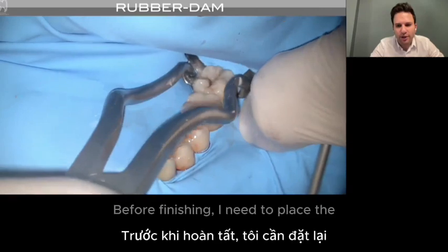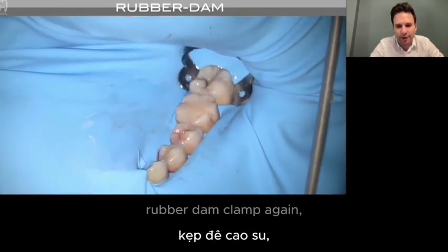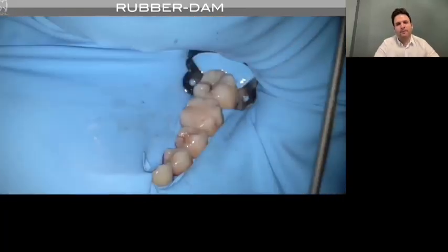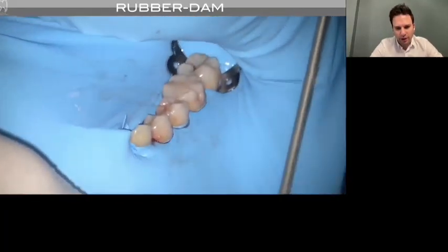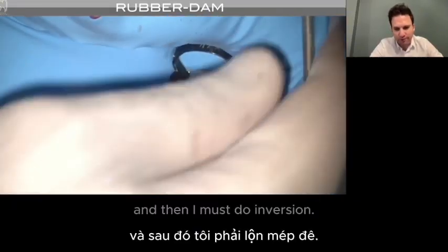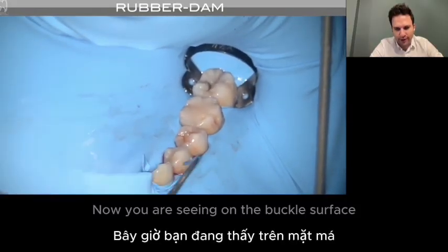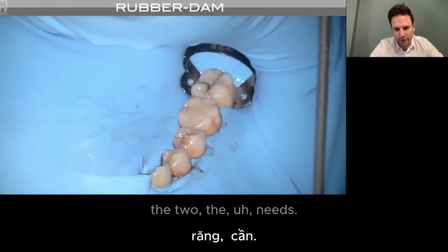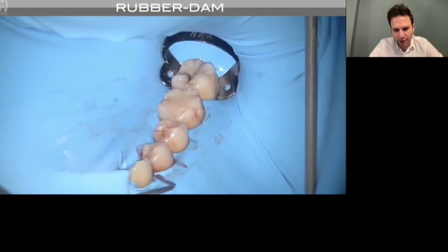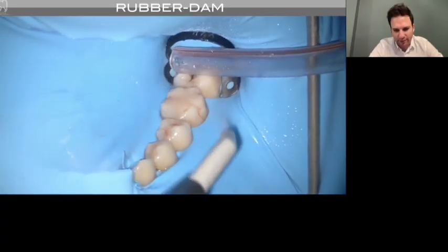Before finishing, I need to place the rubber dam clamp again, and then I must do inversion. Now you are seeing on the buccal surface, the rubber dam needs more inversion to place my rubber dam into the gingival pocket.